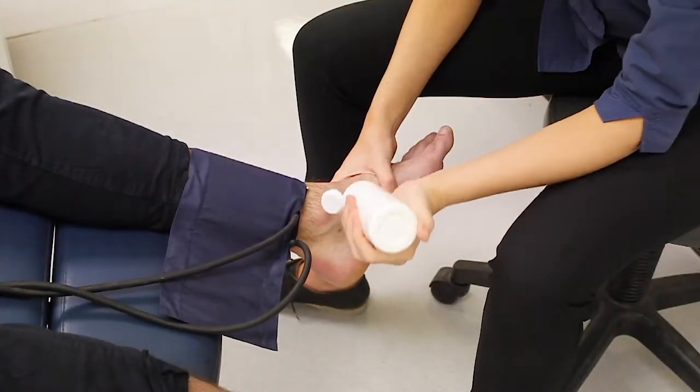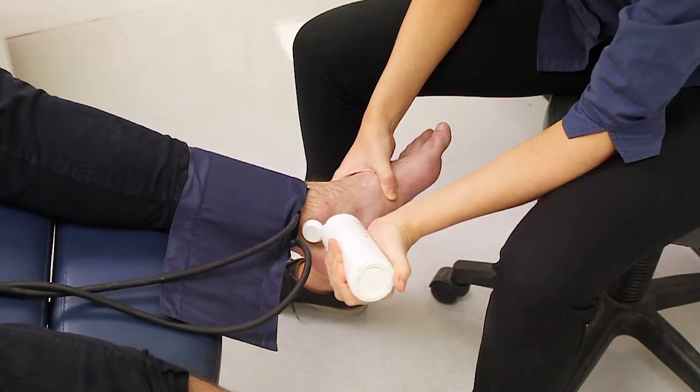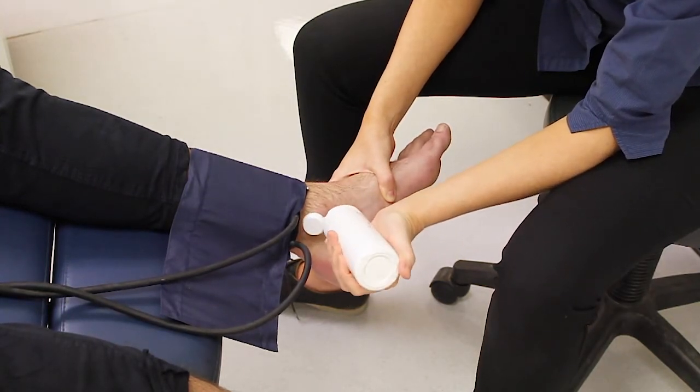Repeat for the inside ankle pulse, taking the pressure up another 20mm, then repeat the timing process.